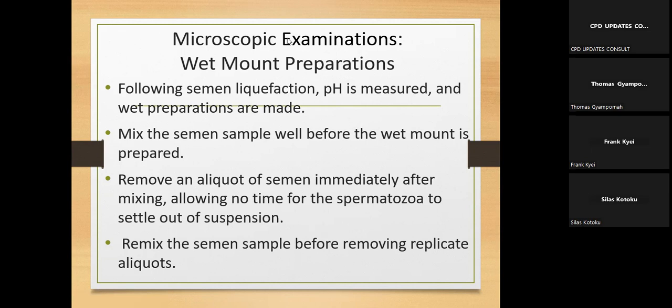Good. Fantastic. Kuda is getting it right. The 10 here is 10 microliters. And 10 microliters is the same thing as 10 millimeter cube, since a millimeter cube is equivalent to 1 microliter.